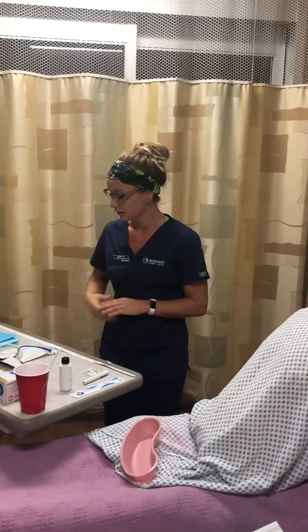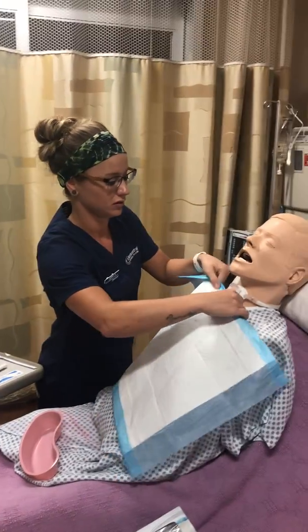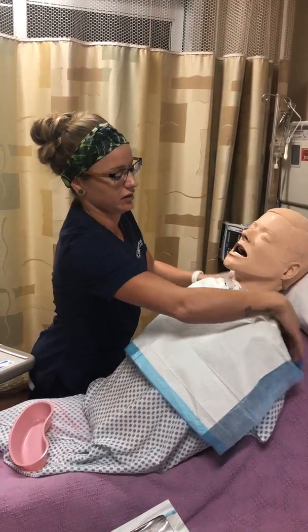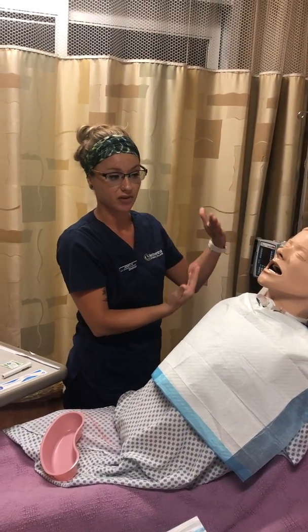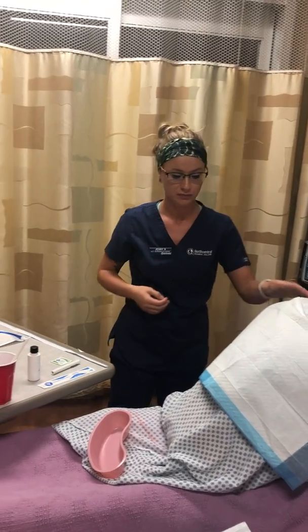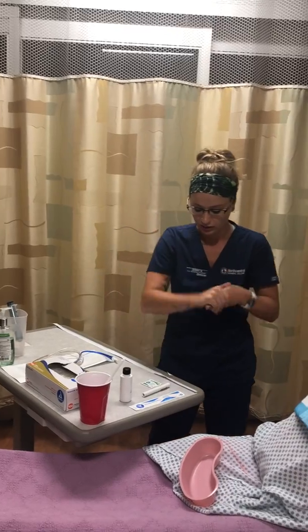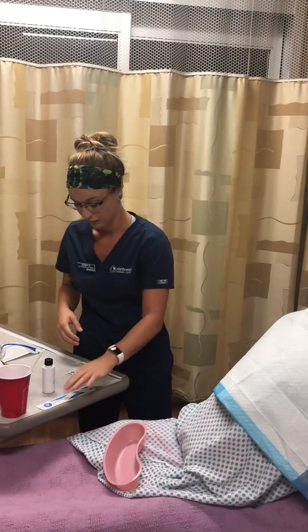Okay, very good. So Jennifer, I'm just going to go ahead and lay this Chuck's pad underneath you. This is just in case any stomach contents aspirate back. I also will place my patient in a high Fowler's position for this procedure. Just going to wash my hands. I already assessed her gag reflex beforehand, and I know that she is able to swallow, and I also know that she is able to follow commands. She knows what to do during this procedure.